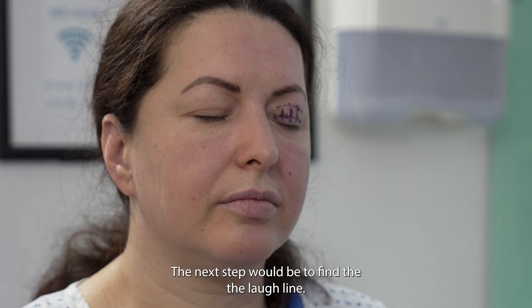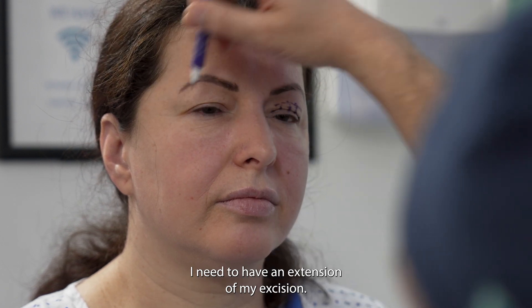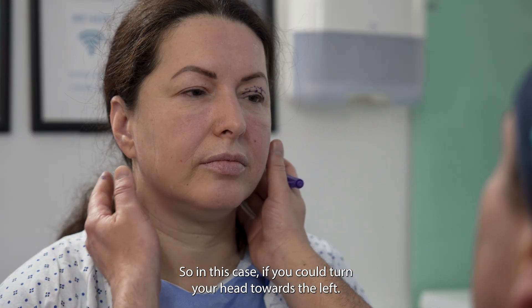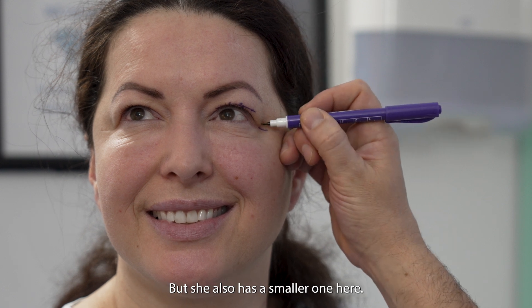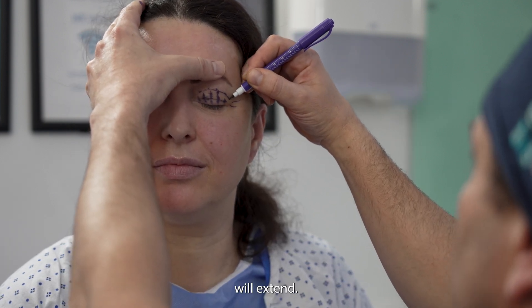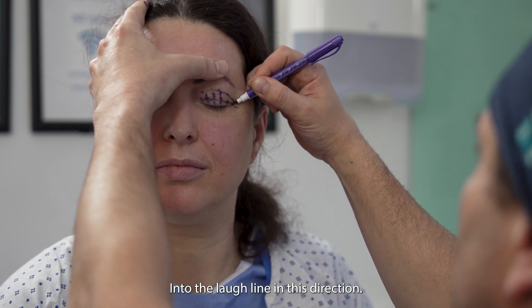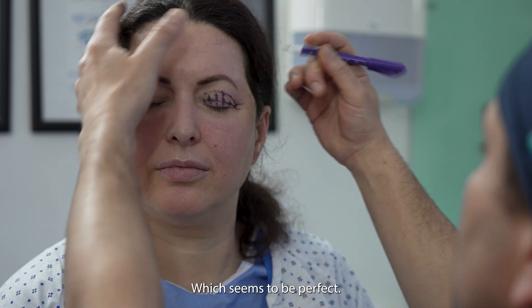The next step is to find the laugh lines. Usually there are three laugh lines on each side, and I need to have an extension of my excision that enters the best laugh line. I ask the patient to turn their head and smile. This seems to be the laugh line that is most marked, though she also has a smaller one here. The excision will extend into the laugh line in this direction, which seems to be perfect.